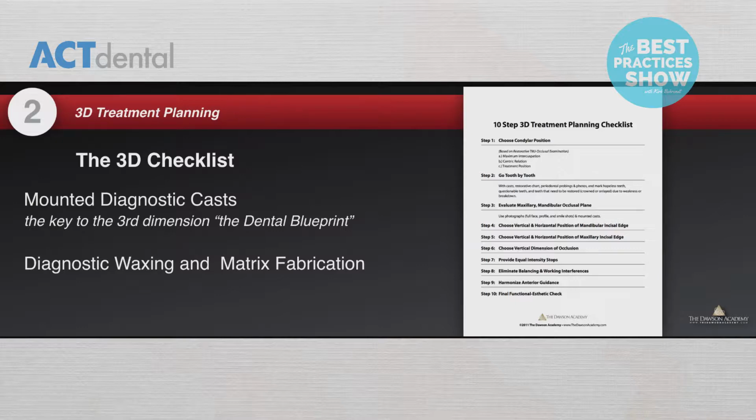Yeah. So, I have that sitting in my lab. I probably do about 50% of my wax ups myself. Much, much larger cases I send out to have waxed up. But even in the ones I send out, I have to do at least half of it myself. So very, very important. This isn't something that you send to your lab and you write a lab script and say, please wax up. There's no direction. There's no information. You're the doctor. Right. You have to answer these questions. If you're going to bring your lab along in this, you have to be able to tell them what they are doing because you're in charge.